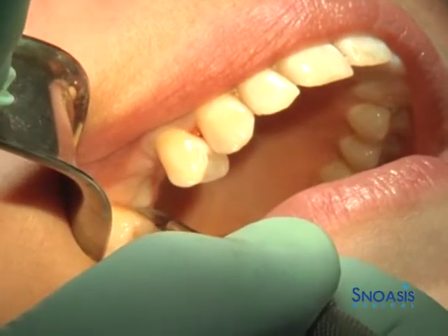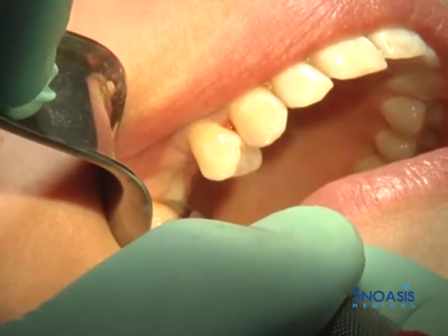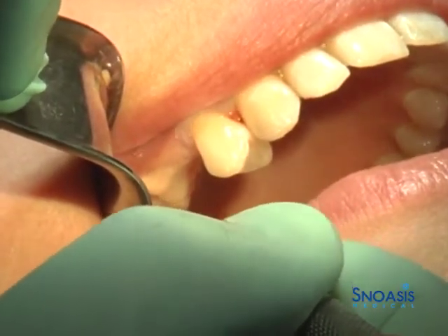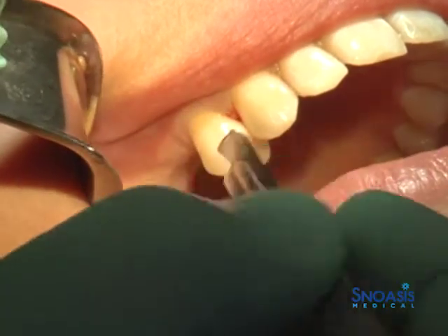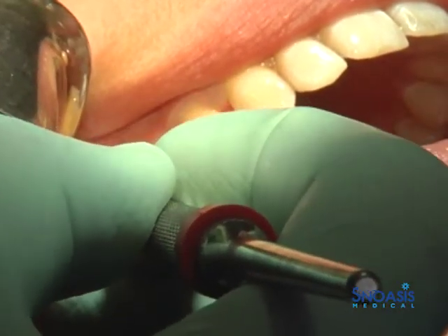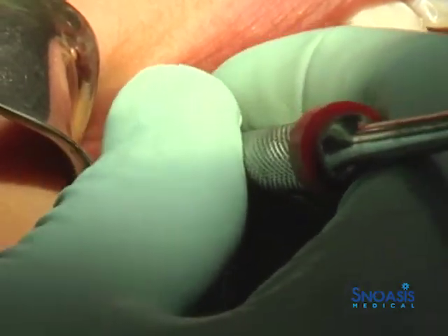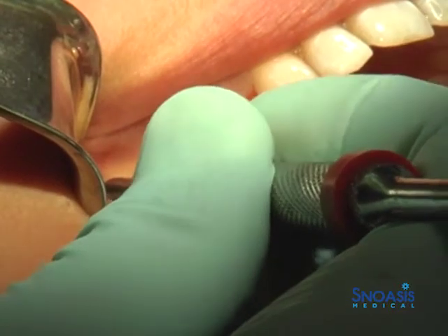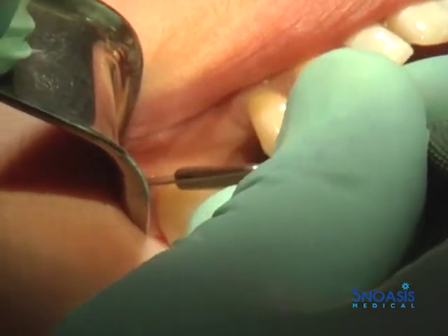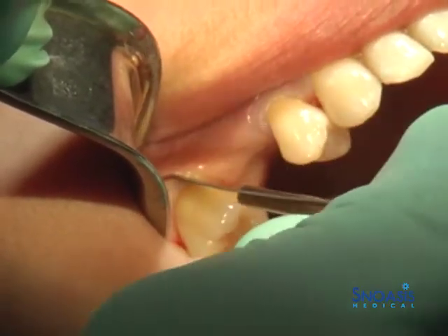This case involves the re-entry for lateral window sinus augmentation and immediate placement of a dental implant in site number four, which was previously occupied by a retained deciduous tooth that was extracted approximately three months prior to re-entry.